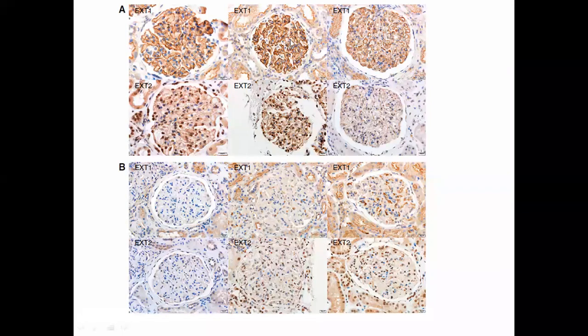This is from the same article where they have said that there is a granular staining along the capillary loop. You can see this brown color. Now the problem is there is a little brown color in the background also. You can see some tubules which are staining with this antibody. So if the background is not clear, it becomes very difficult to interpret these stains. The background has to be clean. As compared to PLA2 or thrombospondin, which will not give any background staining. And based on this article, he suggested exostosin 1 and exostosin 2.